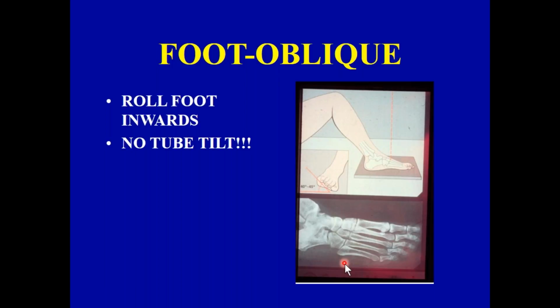So the oblique view is the view that you want to refresh or get familiar with again so that you do it well, because it provides us, people who are looking at these films, the majority of the information.